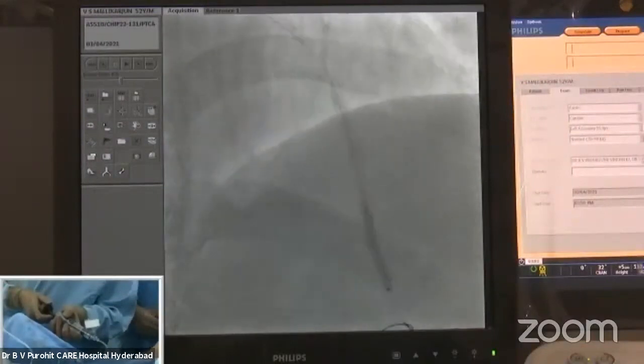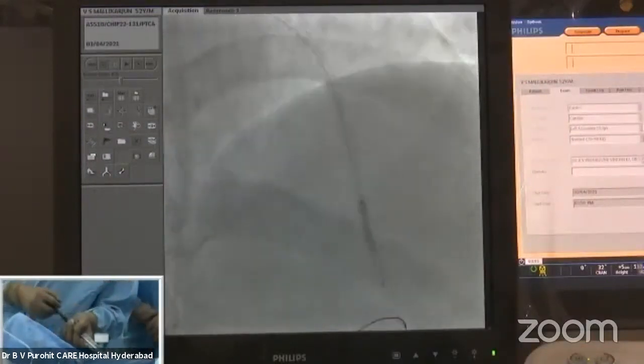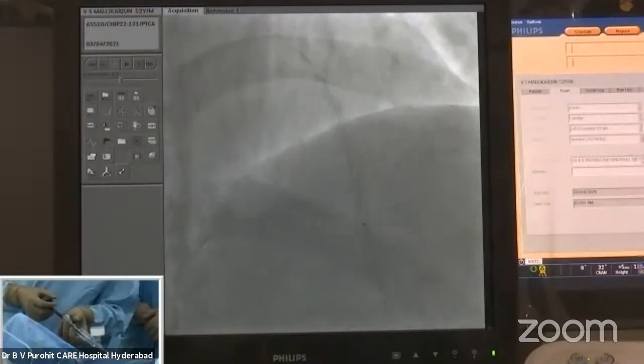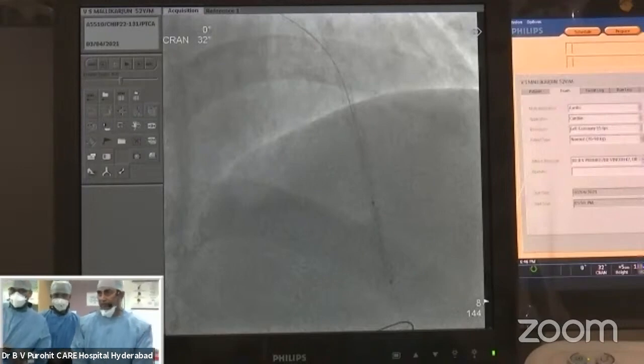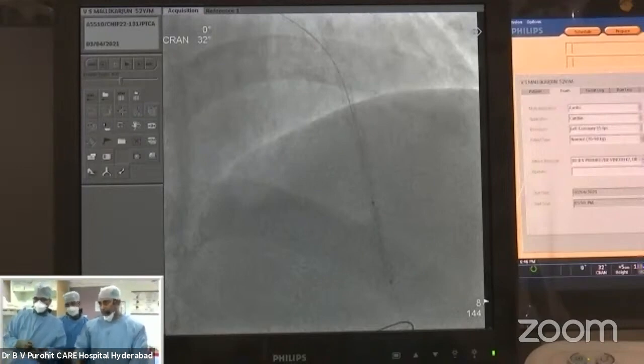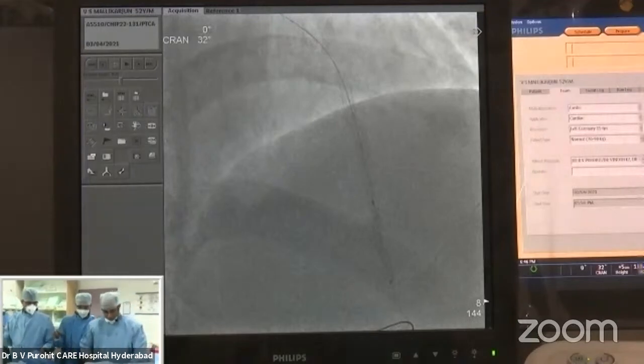The transition is made: moving toward the next case. An important reminder — when post-dilating after new stent implantation, do not dilate outside the new stent into the previously endothelialized old stent, as that would unnecessarily damage it. Keep the post-dilatation balloon exactly within the bounds of the new stent.